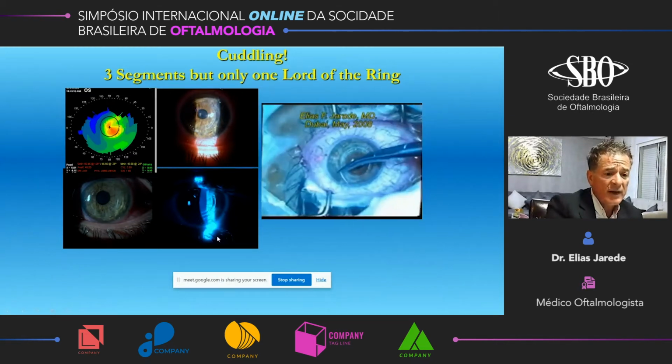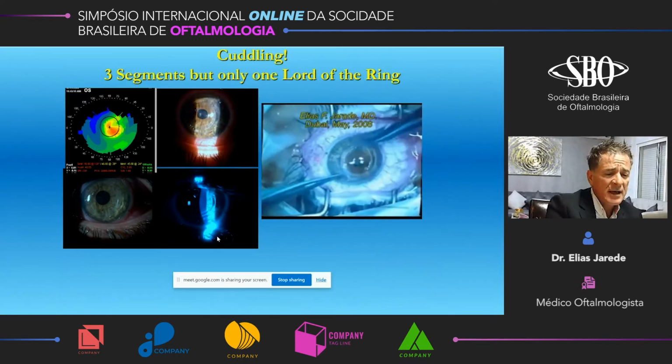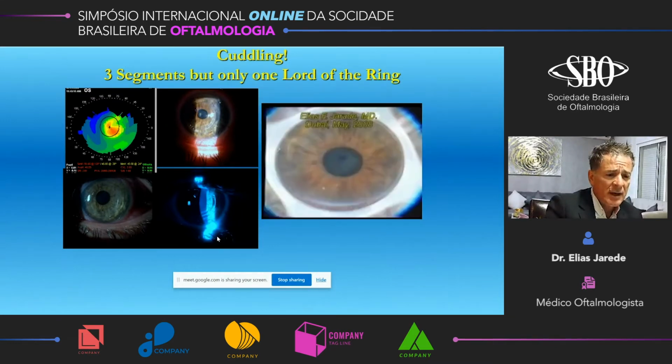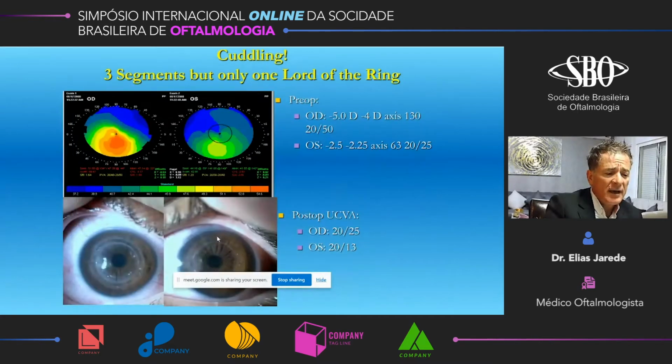Worth mentioning that we did this technique in 2008. We have more than 12 years of follow-up, and the cornea is quite tolerating the three rings without any sign of melting, migration, or inflammation. Moreover, here is another case using the Intacs SK with the Keraring. They are closer to each other, but we have more effect as well in such cases. Three rings: one, two, and three.